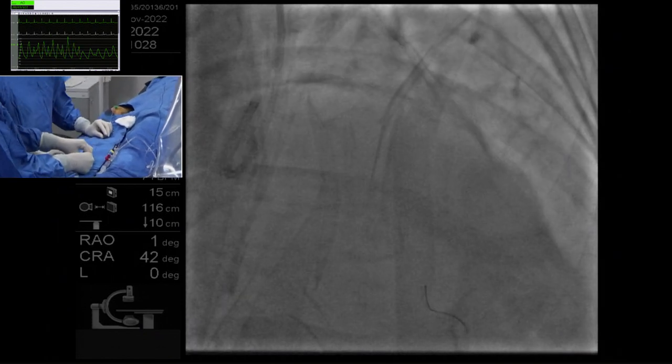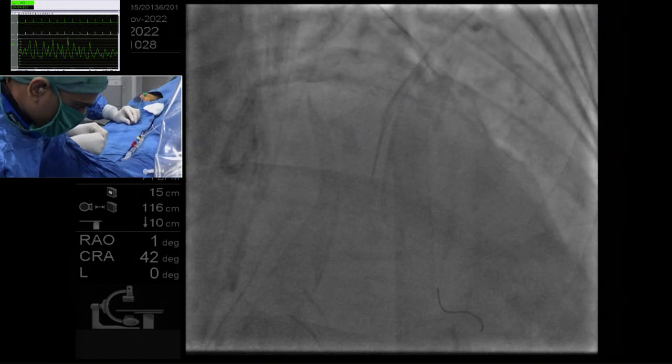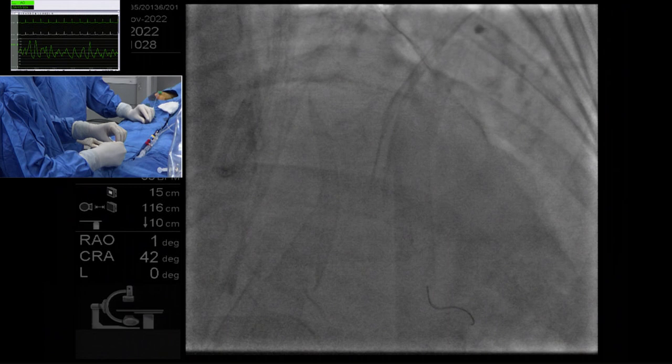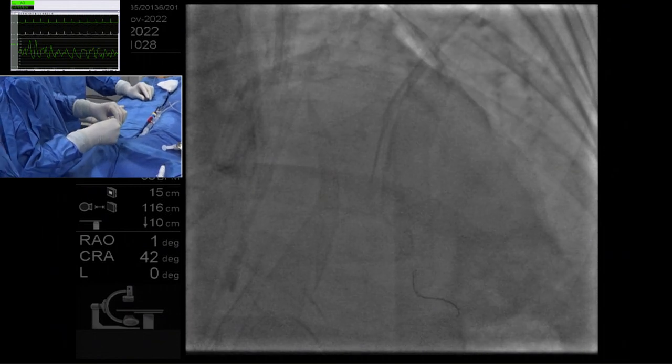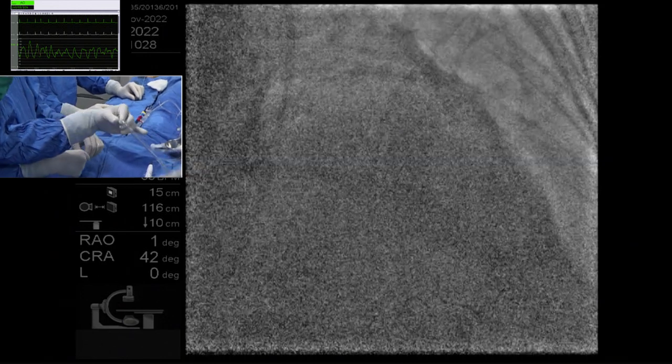I think the CSI wire is a little bit more torqueable than the rotor wire. Microcatheter? Yeah, absolutely. They had a new wire coming out for the CSI wire. It's very, very friendly. The rotor FLOPPY wire is still very difficult to negotiate the bend, the tortuosity.